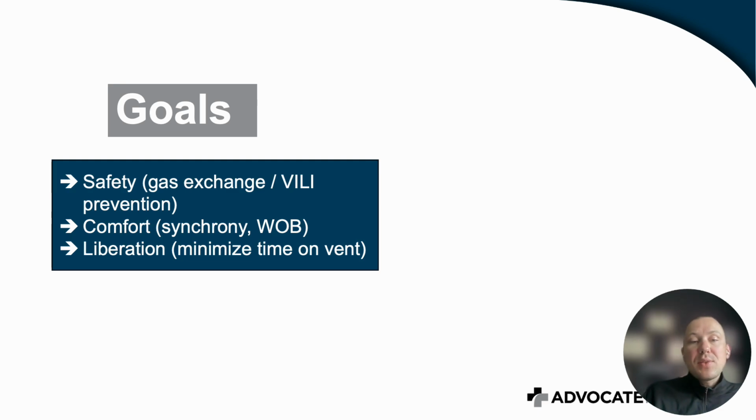When we say the safety goal, what we mean here is gas exchange, meaning the exchange of CO2 and effective transport of O2 across the alveolar capillary membrane, and prevention of ventilator-induced lung injury by limiting the pressure and the volume on the ventilator.